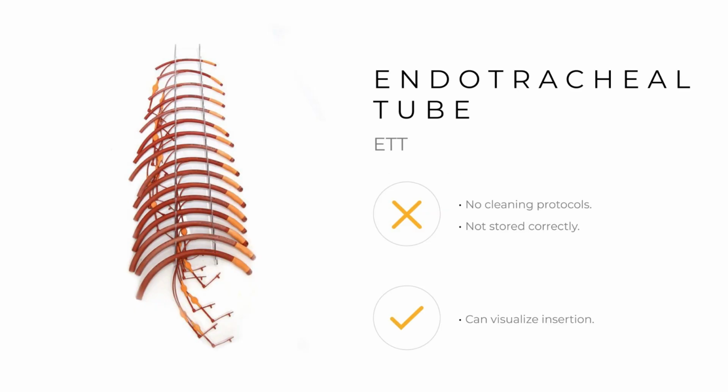Once used, there is no protocol for cleaning ET tubes, as most devices are suitable for single use or minimal use only. They are then often stored on racks in the practice, such as the one shown in the picture, meaning that they are exposed to contaminants, which the next patient will be inhaling. You can visualise insertion during placement of the ET tube, and this is considered as a pro for this device.